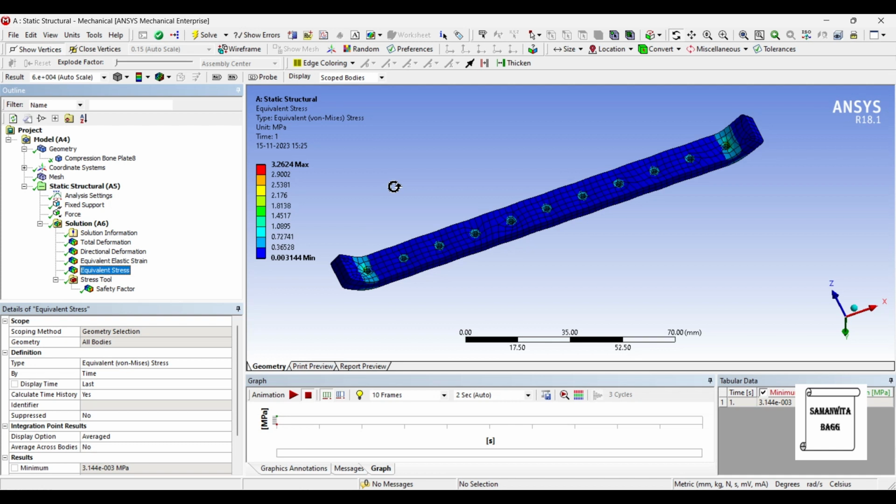It is another grade of steel which is used for this kind of application. The reason being it is more inert and it is going to show better results of strength. But it is ultimately steel, which means the value of yield stress and ultimate stress of the body is going to be quite high. And this value which we are obtaining through this analysis is much, much lesser. It is just 3.26 megapascal, which is a very small value, and generally the value of tensile strength is quite high.